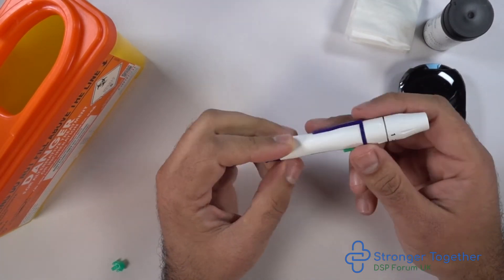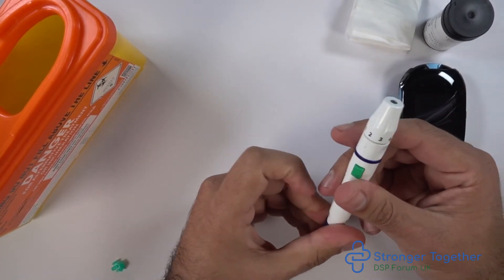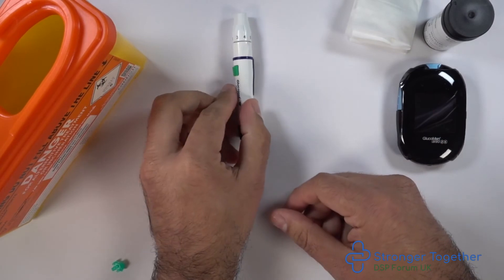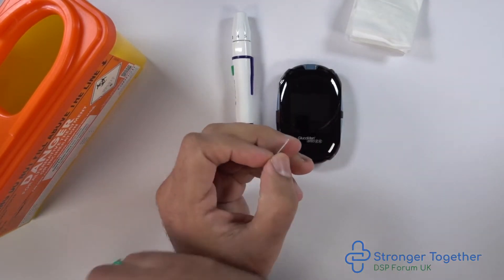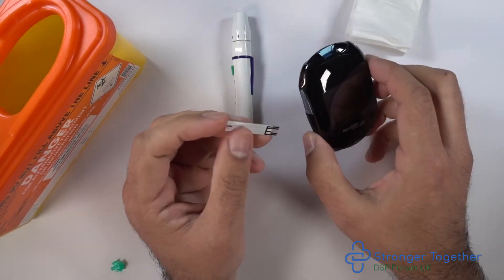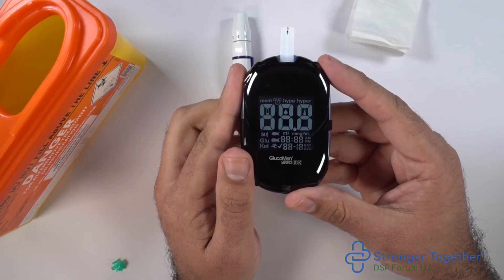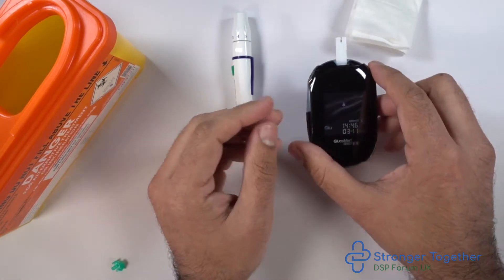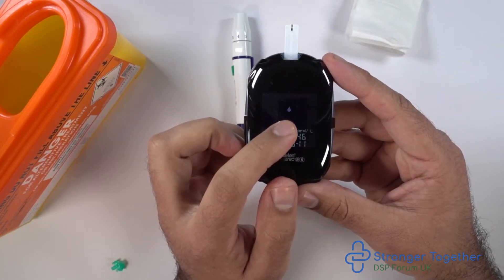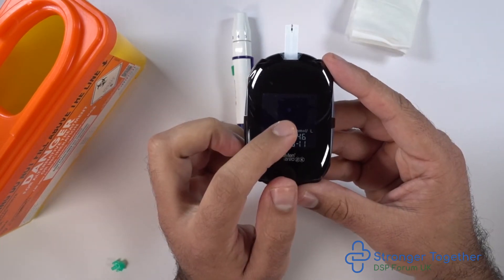You can load your device by pulling back the navy blue plunger on the back of the device. We then take our test strip with the white side facing upwards and the section of the test strip with the black markings in the direction of the test strip slot on the meter. When we insert the test strip into the meter, it switches on and you can see there is a blood drop flashing on the screen. This means it is awaiting your blood sample.